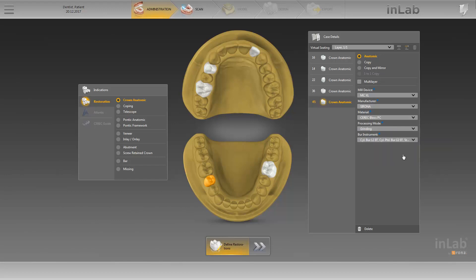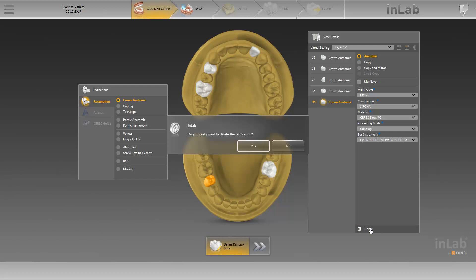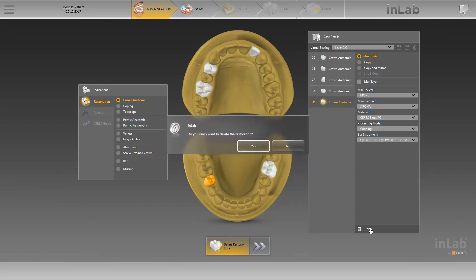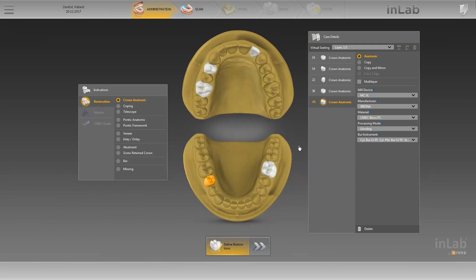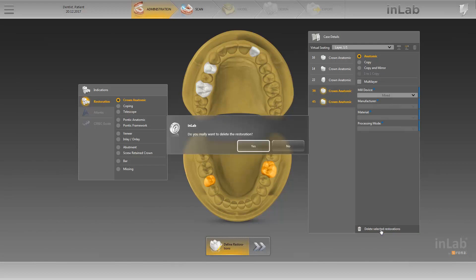You can also delete individual or selected restorations. To do so, click on Delete. For safety reasons, you are asked: Do you really want to delete the restoration? We'll click on No. You can create a new group of restorations by clicking on the restorations in question while simultaneously pressing either the Shift key or the Control key. In our case, we'll use this function to delete both restorations from our case details at the same time. This time we click on Yes.